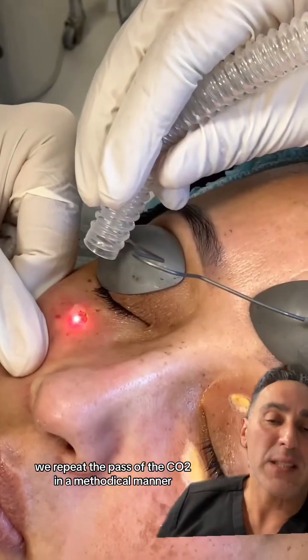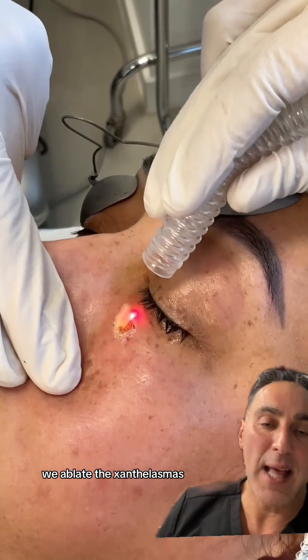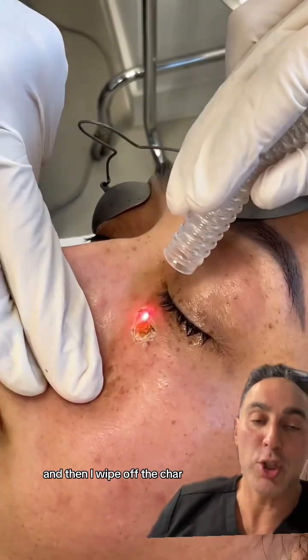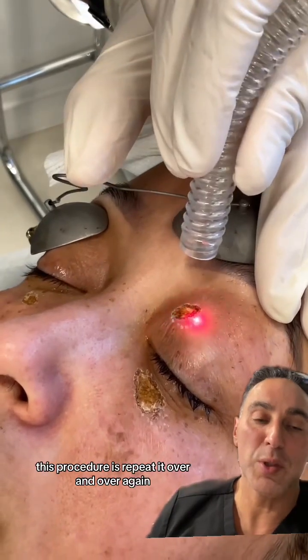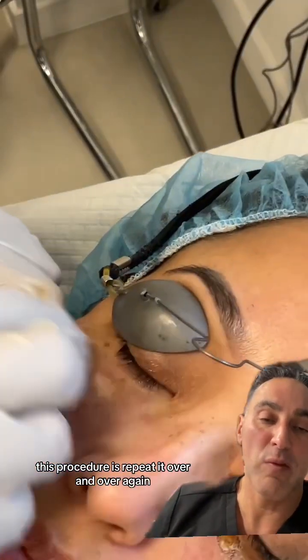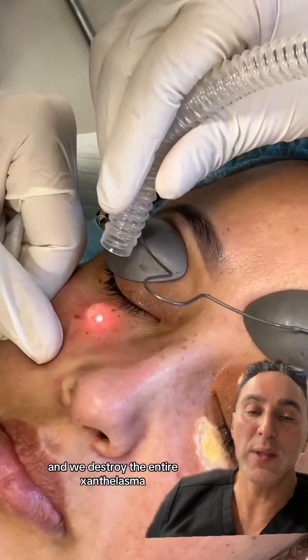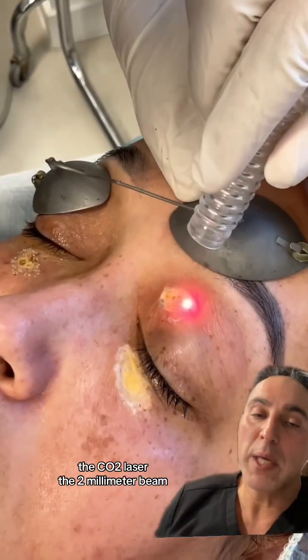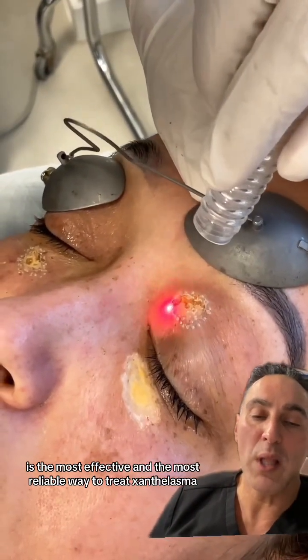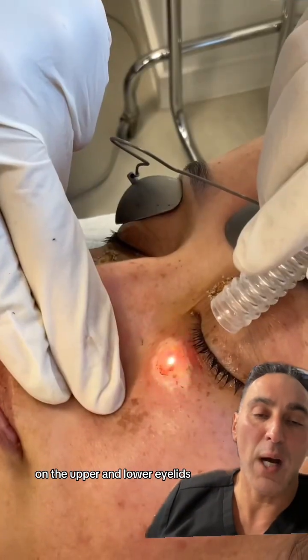With repeated passes of the CO2 in a methodical manner, we ablate the xanthalasmas, and then I wipe off the char with usually wet gauze or wet q-tips. This procedure is repeated over and over again till we get to the bottom of the xanthalasma and we destroy the entire xanthalasma. The CO2 laser, the two millimeter beam, is the most effective and most reliable way to treat xanthalasma on the upper and lower eyelids.